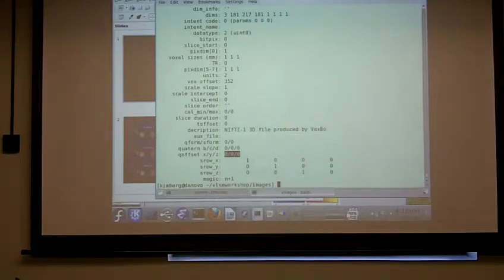I don't know. What programs says? Ants. Ants. So probably Olu might have some. I'm not quite sure. The only thing I can think of is that it's an origin that's set from the scanner. No. Yeah. Well, if it's calculated from Nifty files, it's getting them from somewhere in this header. I imagine it's calculated from the same orientation information. Okay. Probably if you sat down with a calculator, you could figure it out.